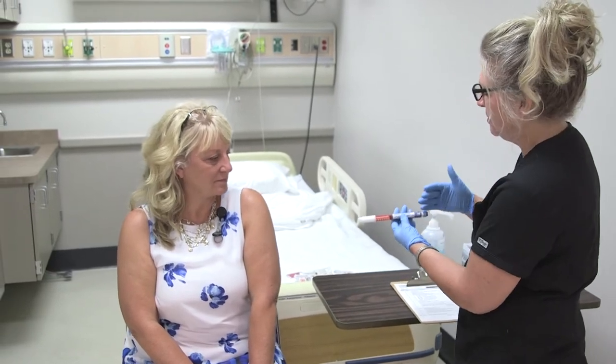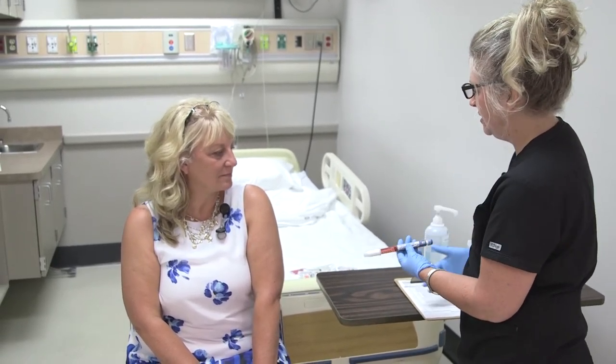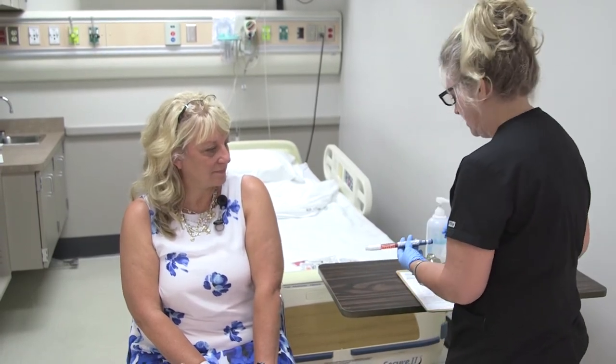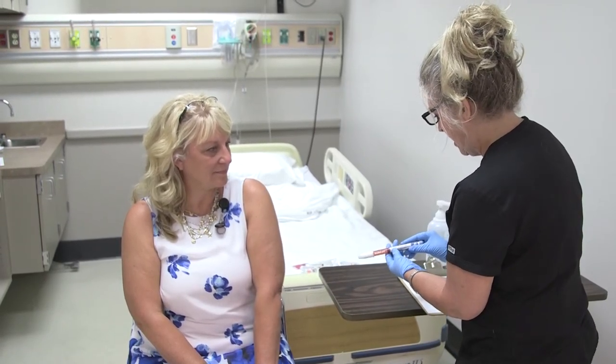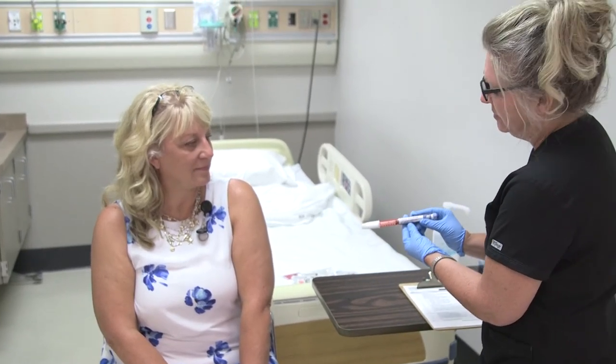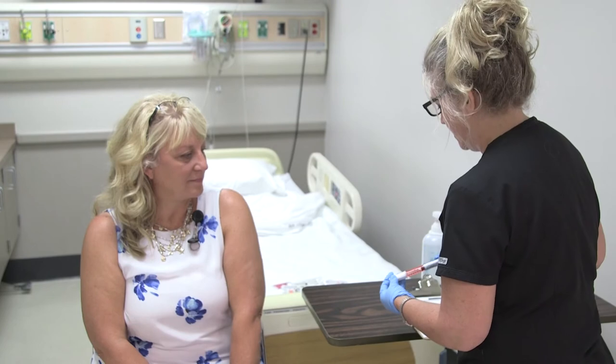We already have our dose set. We did our first two checks at the Pyxis and will do our third check here in the room with the patient, scanner, and computer to verify the right dose and medication. You also want to double-check with another RN to confirm you have the right dose and the right medication before giving it to the patient.